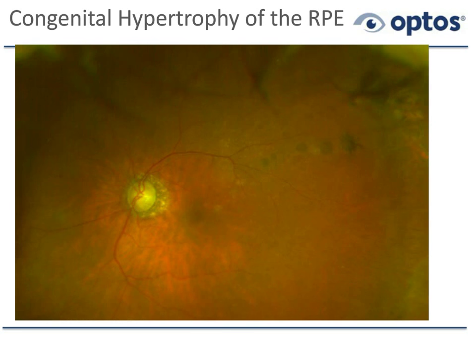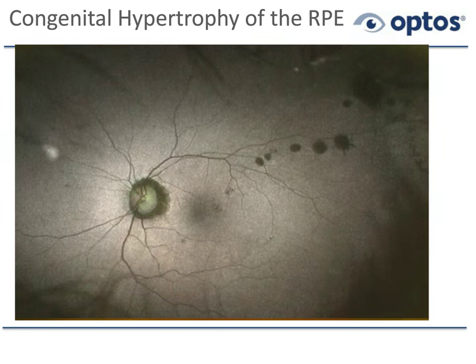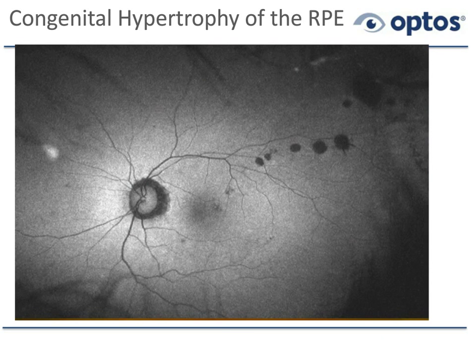Congenital hypertrophy of the RPE — CHRPE, known as CHRPE lesions. In color, and now on autofluorescence, these lesions appear dark. According to Carol Shields, who has seen about 250 of these, in every single case CHRPE lesions are hypoautofluorescent. This is an exception: it doesn't mean we have dead RPE. OCTs through these lesions show the RPE is still present, but the photoreceptors above it are absent, so lipofuscin is not being produced. About 10% of eyes have CHRPE lesions, and the same number have nevi — they look very different on autofluorescence.